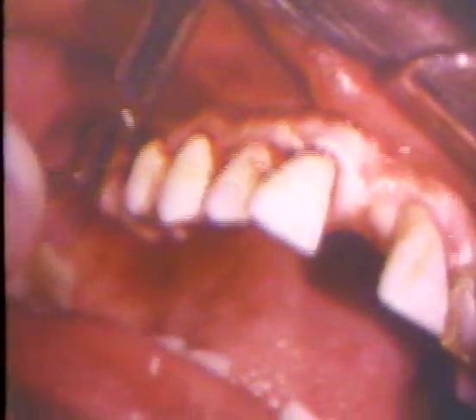Once the internal bevel incision has been completed on the buccal and palatal surfaces, the number 11 Goldman-Fox knife, which is an interproximal knife, is used to cut the inner ring of the pocket. This tissue is removed from the palatal aspects of all teeth in the area. Tags of tissue are also removed. Once this inner lining has been taken out, one will be able to reflect the flap.